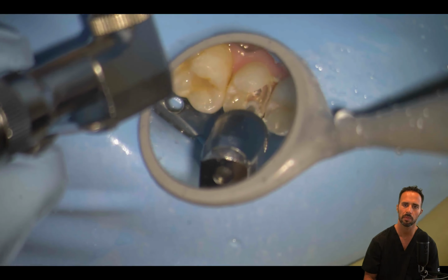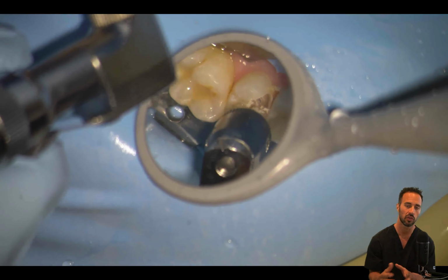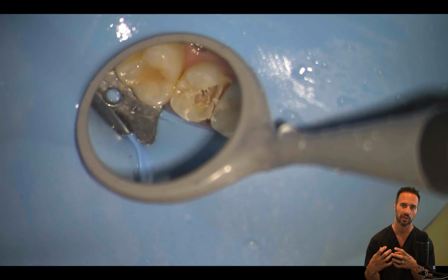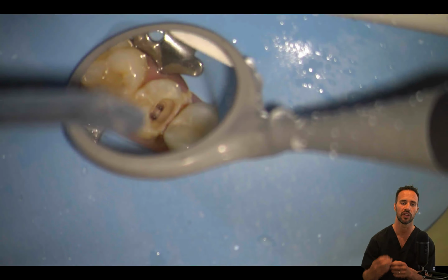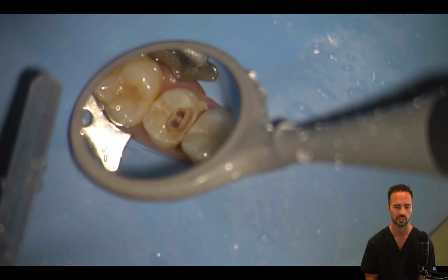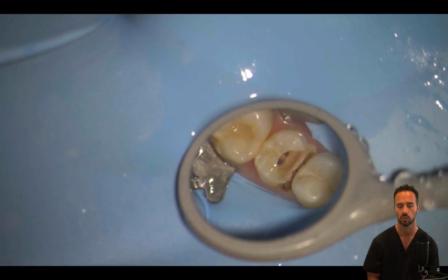And sometimes there's some pulp tissue just beyond that hasn't been fully unroofed. And so you want to just take your time and make sure that coronal area is nice and dry and you have good control of the case, in terms of the unroofing of all the pulp horns. But you can see it's starting to look nice and clean in there, nice and neat, and it's on its way.